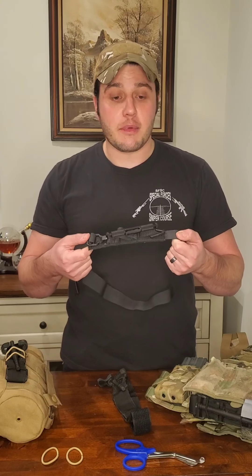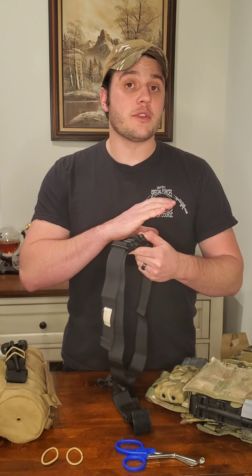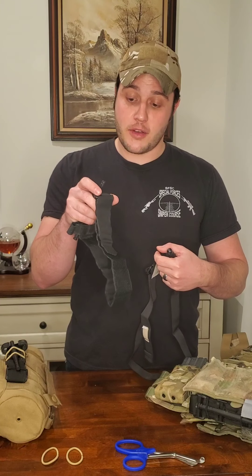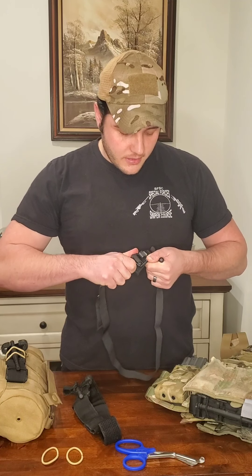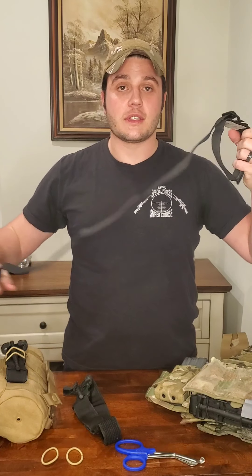Two things I actually like about the Soft-T Wide. One, it's a little bit wider, meaning you have a wider surface compressing that artery, which means less pain for the patient. Two, as opposed to having to feed the running end through a buckle — which under critical stress might be difficult — the Soft-T has a clip. All you do is pull the running end out of the clip, pass it around your leg, clip it back, pull and tighten, just the same as you would any other tourniquet.